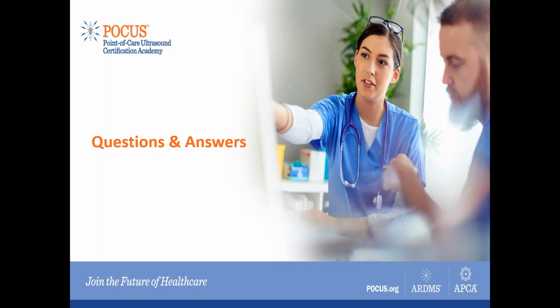That shouldn't scare you, because you can perhaps plan to do a full study anyway, and you do a prospective study and you note down your findings, get a full study done, and then see how far off you were, or were you totally consistent with the findings of the radiology group. Or the other way you can do is you can have a patient who has a DVT, and you scan yourself and determine where the clot is, and then you can compare the results, and based upon that you can decide how good you are. So that's how you build confidence. But to answer your question, every physician, as we know, is responsible for their actions, medical legal, if we make any judgment or treatment based upon our own findings.